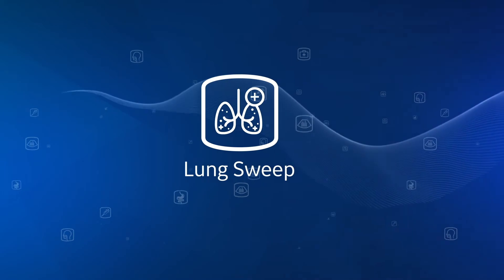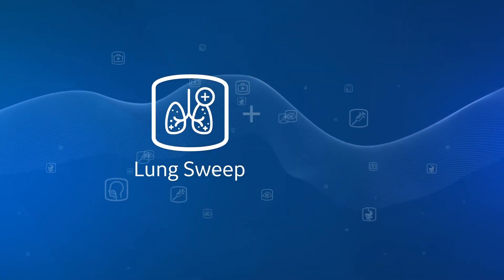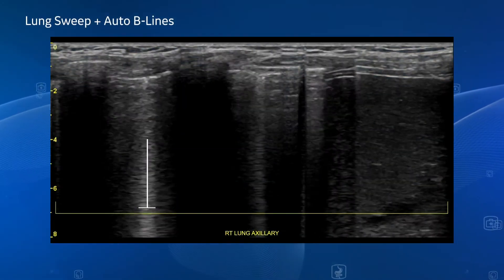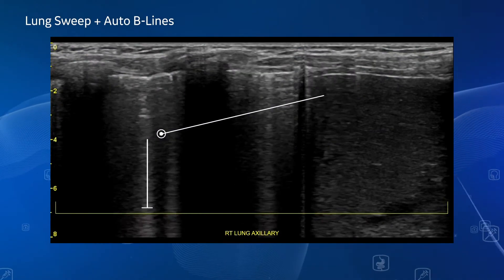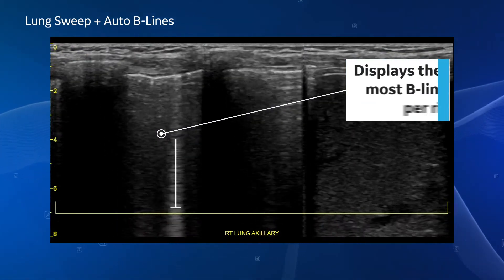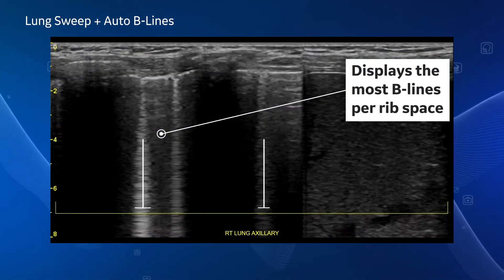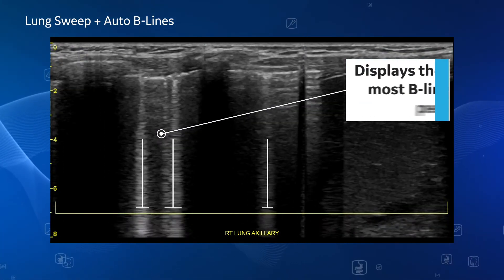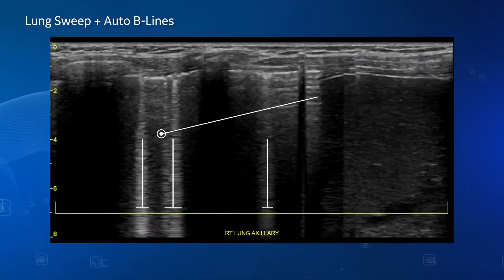When used within the Lung Sweep tool, the Auto Beelines tool automatically finds and displays the frame with the most beelines to avoid scrolling through all images.